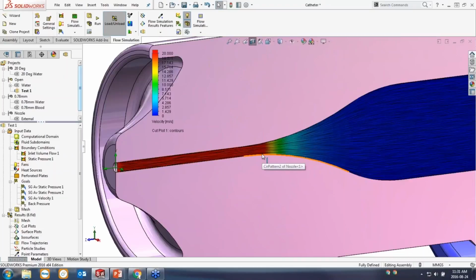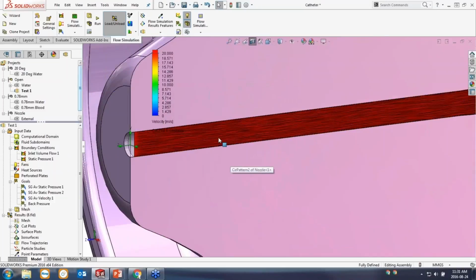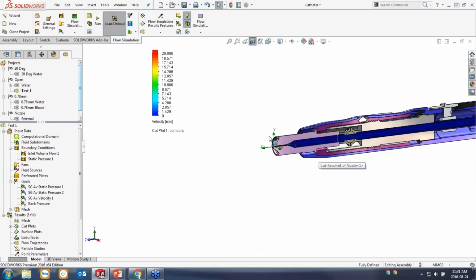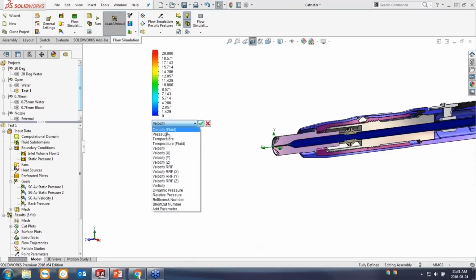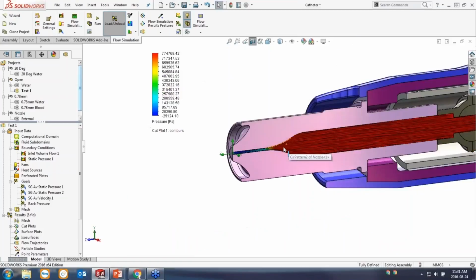Maybe my solution, whatever's being suspended, isn't going to hold together well at that speed, or maybe it's just going to exit too fast. It's going to cause a problem for whatever's out here that we're applying the medicine to. And we can see that that's really just because our constriction is too narrow. So maybe we need to open up that a little bit, or maybe we need to push a slower flow rate. Okay, so a cut plot is a great way to get some understanding of what's happening through your model.